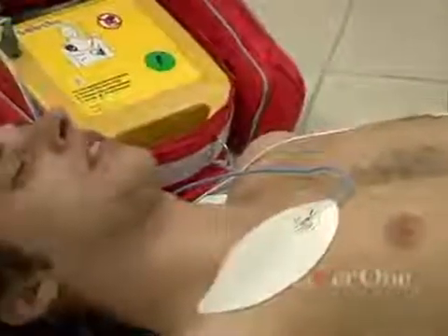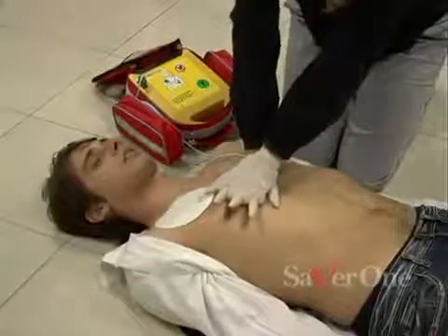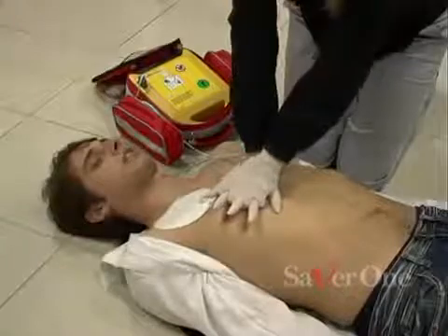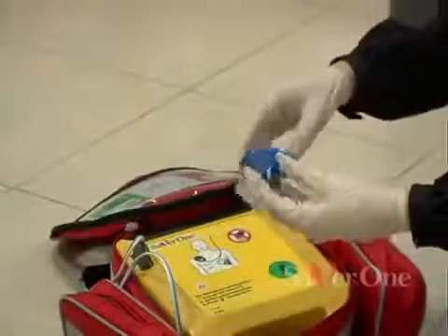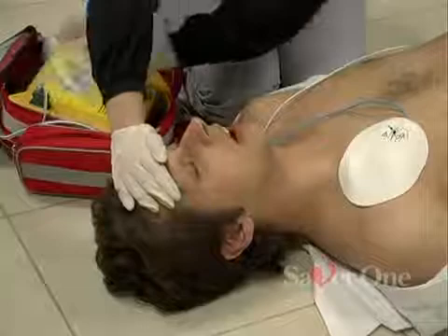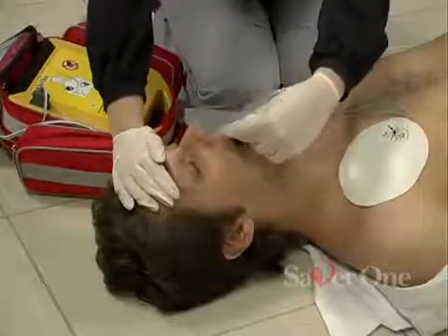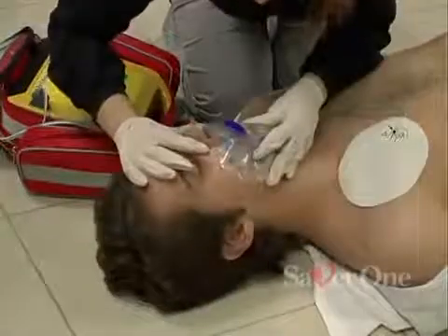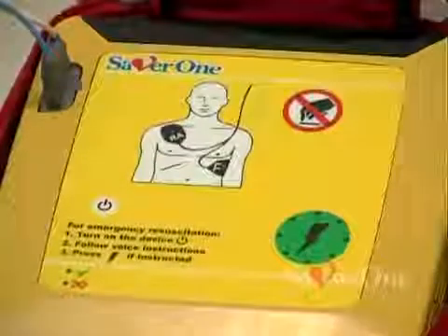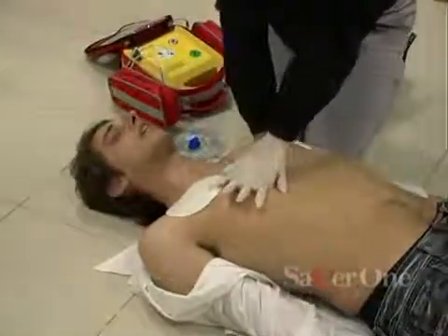Shock delivered. Begin CPR now — press patient's chest down fast. Give two breaths. The defibrillator will assist the rescuer throughout the CPR, then it will analyze again the ECG of the patient to check his state. Go on with the CPR until professional rescuers arrive.